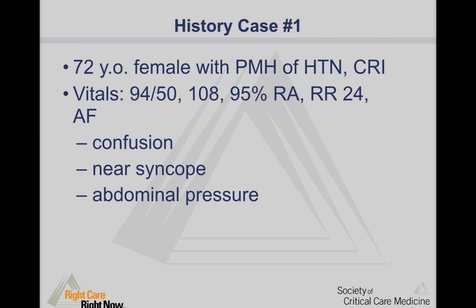Hey guys, in lieu of the follow-up conference yesterday in M&M, in which we had a few cases of dissections diagnosed with CAT scan, one of which was augmented or helped with the use of ultrasound, I wanted to present a case to you that I actually gave last year at a critical care medicine conference.